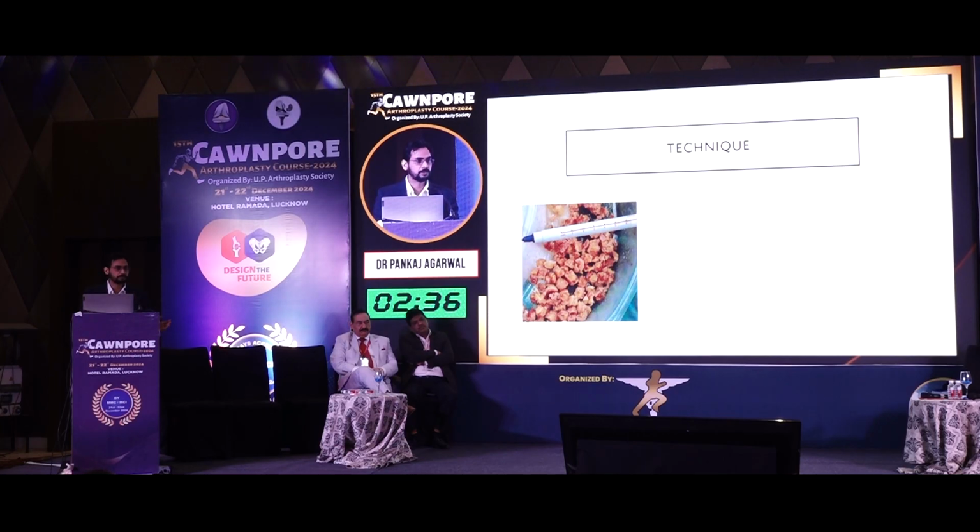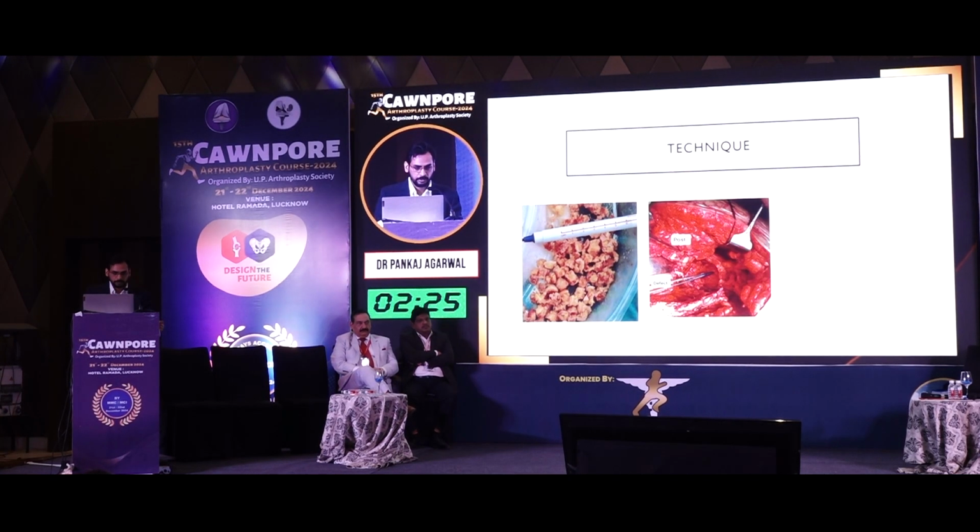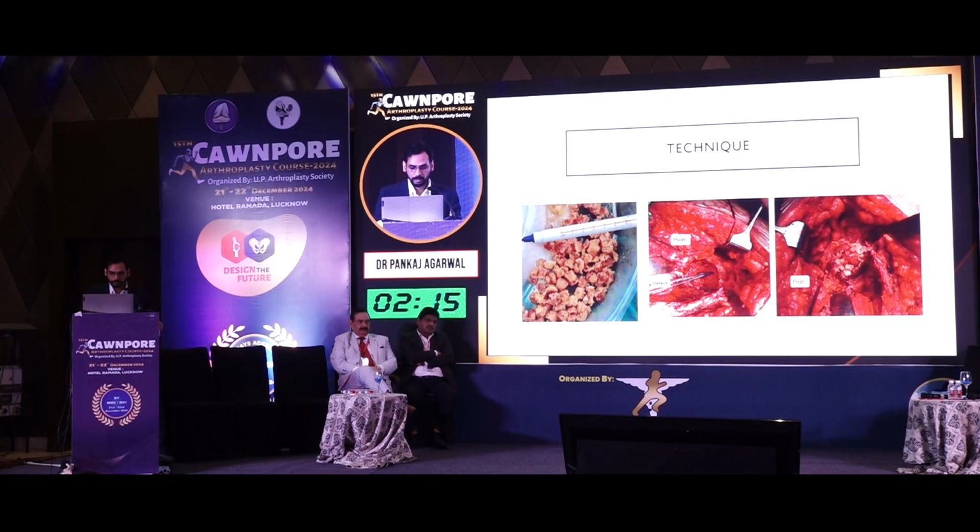So these are the sizes that we would typically want. This can be achieved by using the autograft femoral head or allograft, and one should use bone nibblers to make these large 8 to 10 mm size graft particles. And one should assess the depth of the cavity and the amount of layer of bone that has to be recreated, and then impact the graft in place.